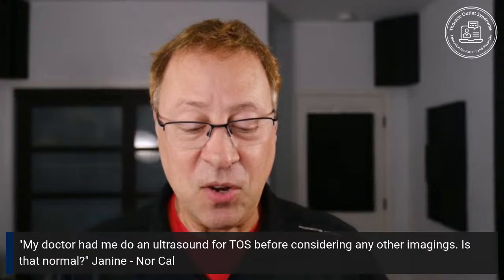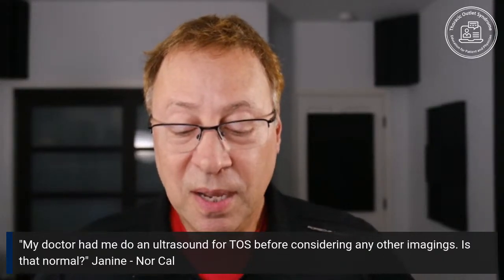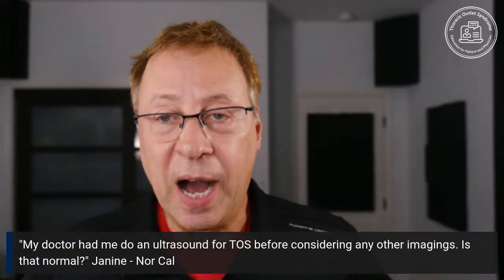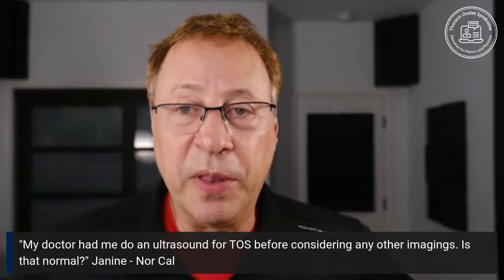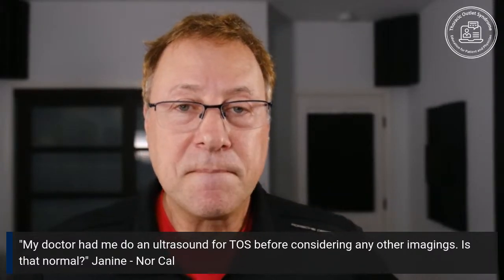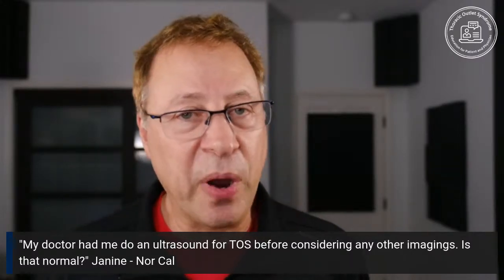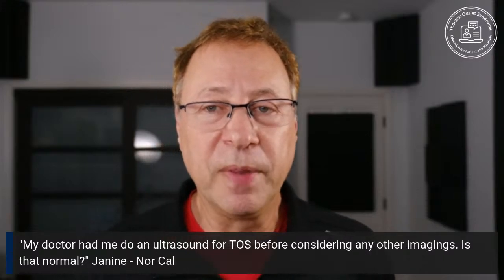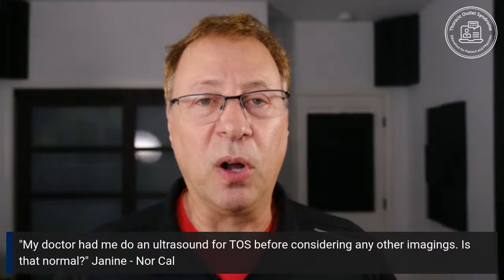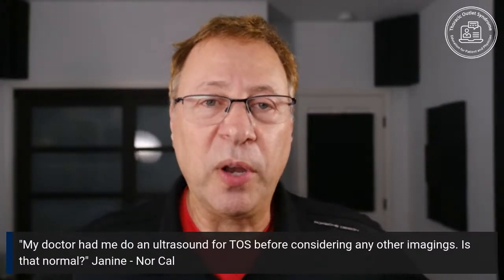All right. Janine in Northern California says, my doctor had me do an ultrasound for TOS before considering any other imaging. Is that normal? Now, this depends on the doc. You probably all know that there are many different specialists that treat TOS patients. TOS has never been a field that's been owned by one specialty. So you may have a doc who's got a preference for one type of imaging. I know at Stanford, they published a paper a few years ago with a team that said, we do ultrasound on everybody. And when you read the paper, they're basically looking at the blood vessels.